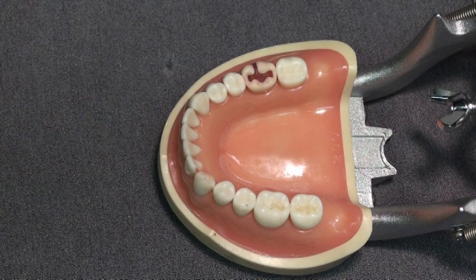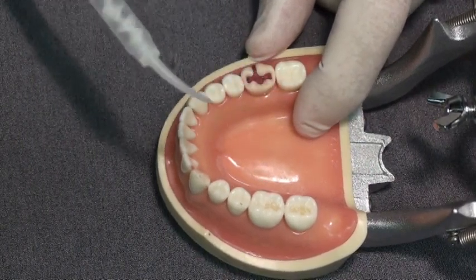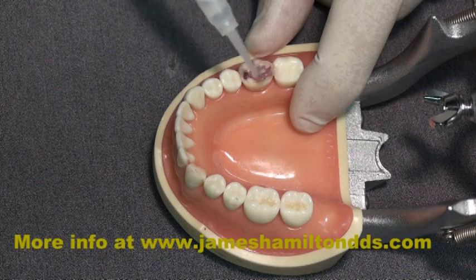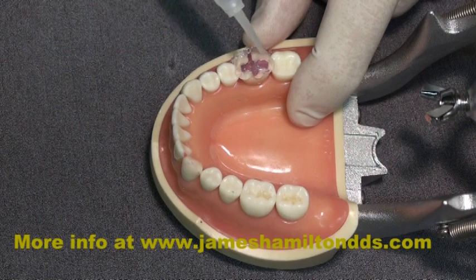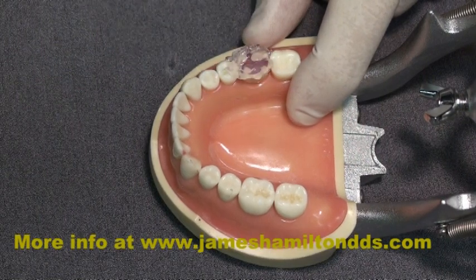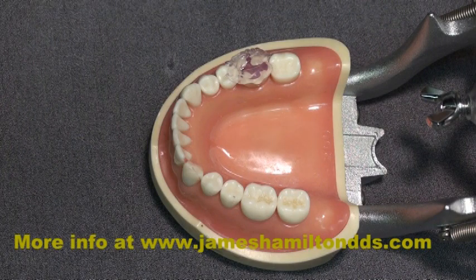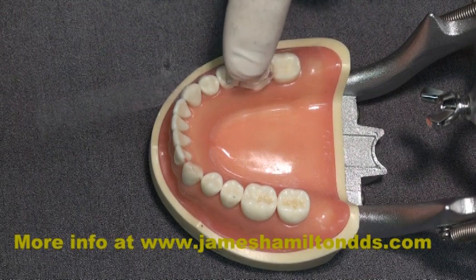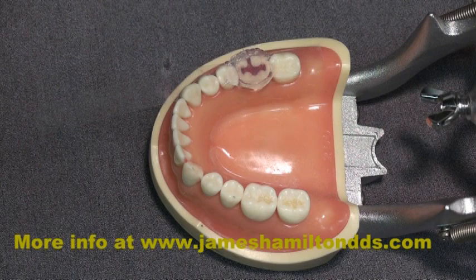This impression goes very quickly. I'm going to get a clear bite registration material down to the end of this static mixing tip — an intraoral syringe tip — and run that over the surface of the tooth and then over the buccal surface. Now we're going to take a Mylar strip and create a flat, smooth surface on the occlusal surface, which will allow an even surface for us to place the light curing bundle on and to put even pressure when we light cure through this later on in the procedure. In the mouth, this sets within about 45 seconds — by the time we take the Mylar strip off and remove this small impression, the patient has not gained anesthesia, so we have not lost any chair time.